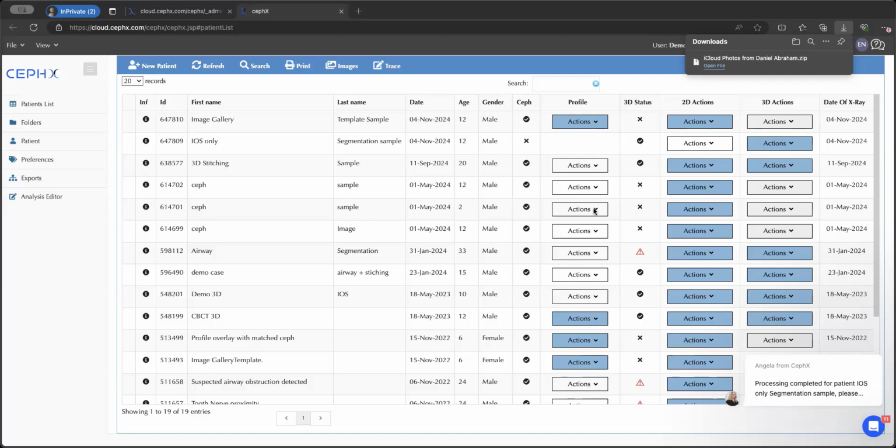We are integrated with a lot of PMSs, labs, imaging centers, imaging devices like Planmeca, Sirona, Cephala, and so on. We have a set of patents. We have our own huge data set, and we're very focused on orthodontics and leading the way in orthodontics in general.